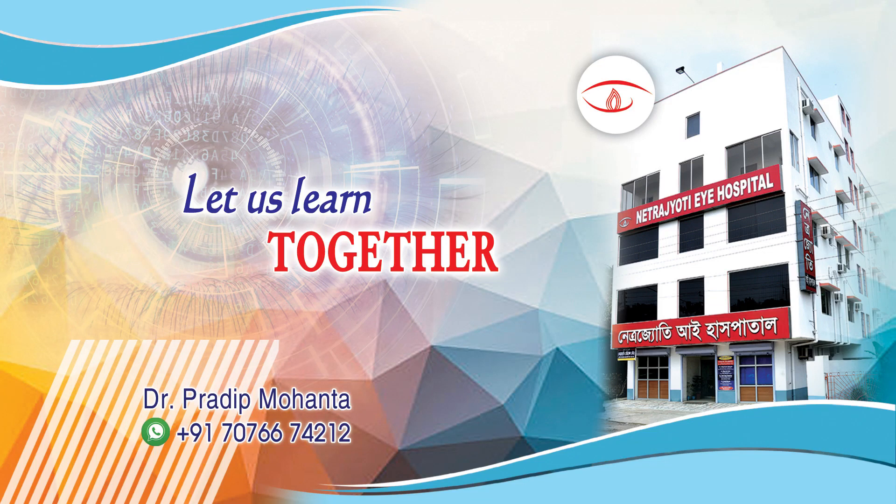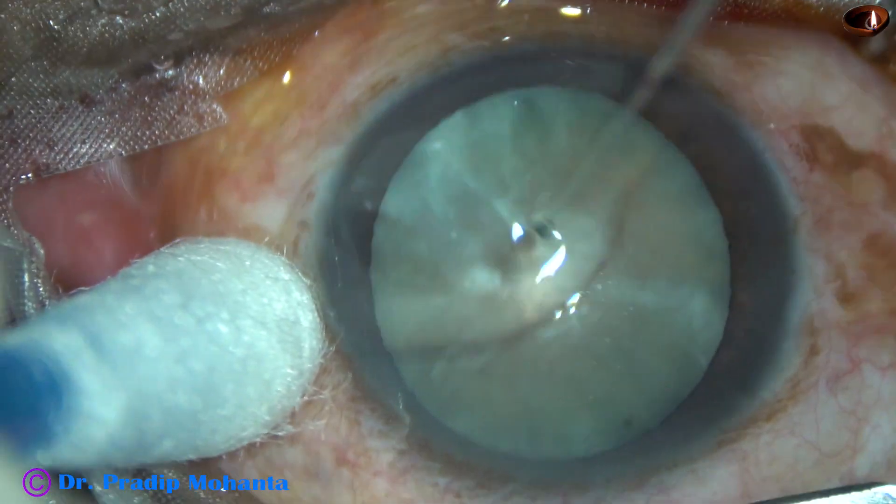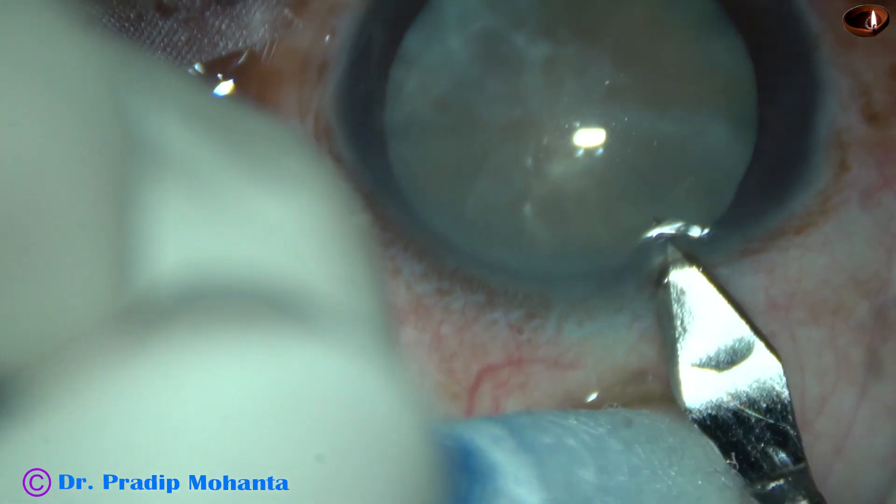Friends, welcome to my workplace at Ranaghat, West Bengal, India. This is a white cataract with fibrosis beneath the anterior capsule. Let us observe this surgery.